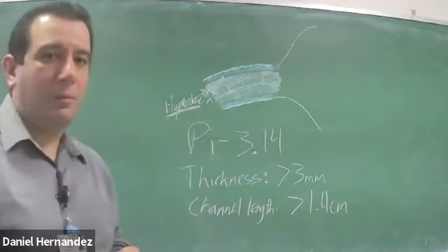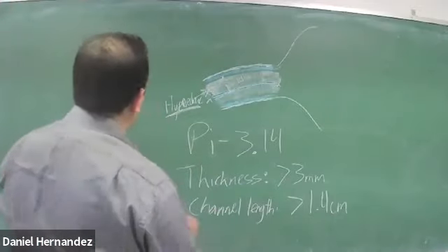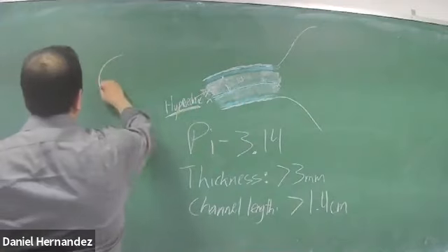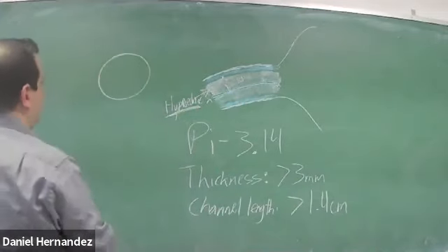So again, our most accurate measurements, you could take one in your long view, but it's important to also try and get a transverse view of that pyloric channel.